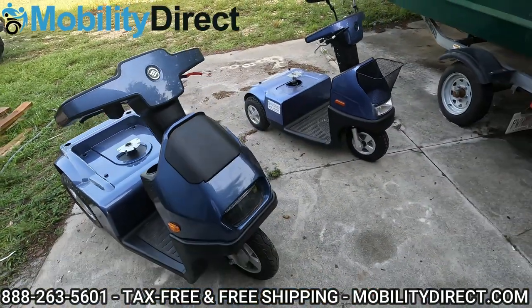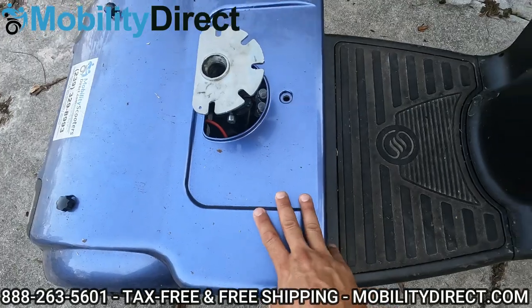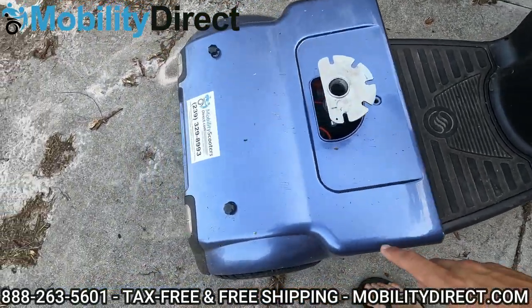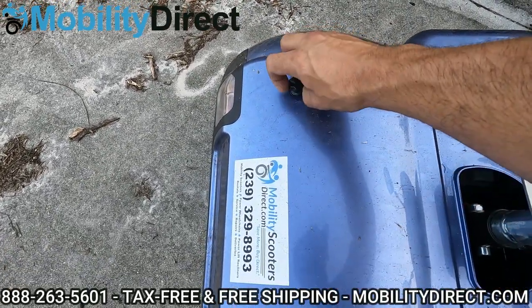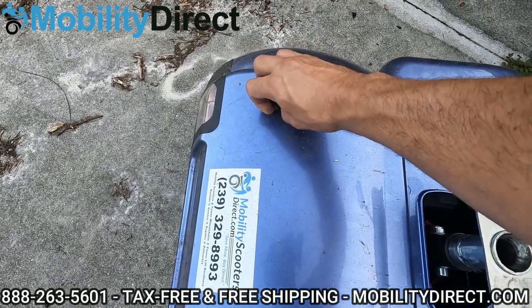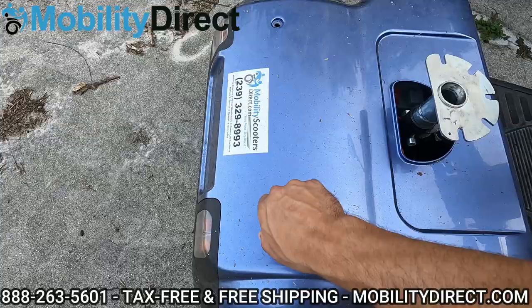All right, now that we have the seats off, you can see that on both models there are seat posts that come up through the main shroud, which is used to cover up the controller and the batteries. There are some hand-turning knob nuts here, and over time you may lose these. If you need to get new replacement knobs for your shroud covers, give us a call — we do sell the parts.